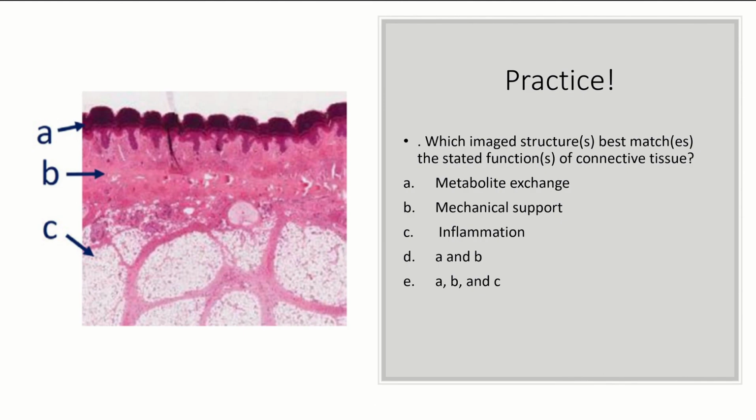So now we're just going to go over some questions really quickly to see if you learned anything, if you remember any of this. So which image structure best matches the stated functions of connective tissue? Okay, connective tissue. So the first thing I'm gonna kind of point out is when we look at A, what is A pointing to? Right? Remember, we learned this week, this is epithelium.